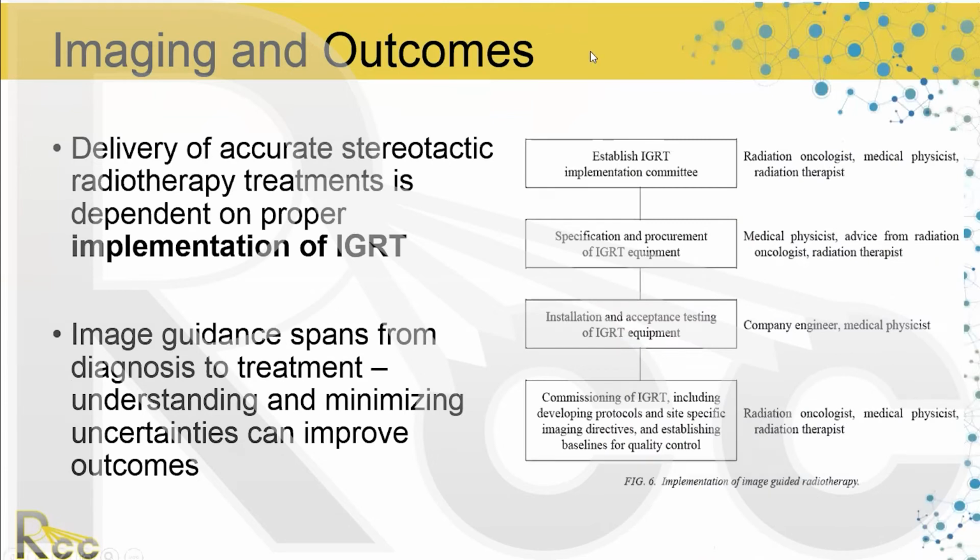So with regard to stereotactic, this is the end of your symposium, your series of training lectures. You've gone over stereotactic many times, and you know that it is critical to get it right, because you don't have room for error. There's not 25 more fractions to make up for or to feather out a misalignment. So implementation of IGRT is essential, and it shouldn't be overlooked as just a piece of things. It actually is important in its own right, and implementing IGRT properly carries through to all your treatments, from your 3D to your IMRT and your stereotactic.